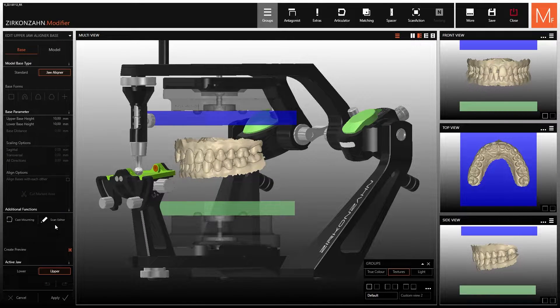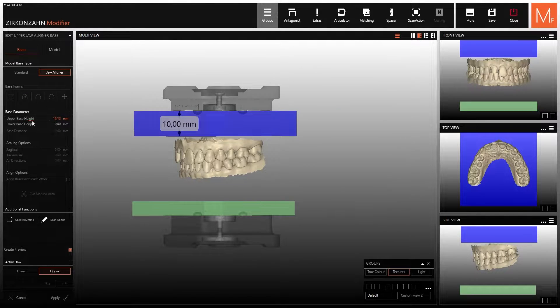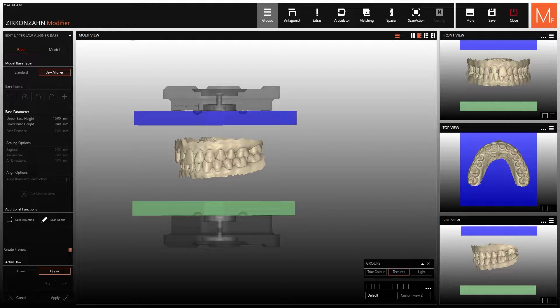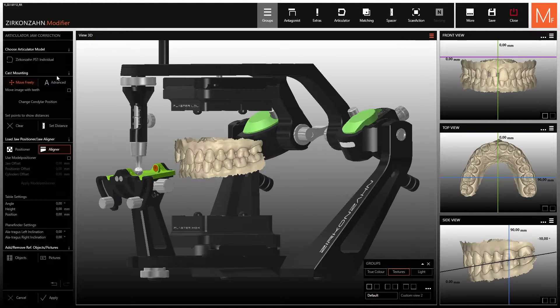You can modify the height of the blue and green model bases placed in relation to the jaw aligner plates. If the model height is too high and you do not want to waste so much printing material, go back into the jaw aligner function and click on one of the two bases with the right mouse button.